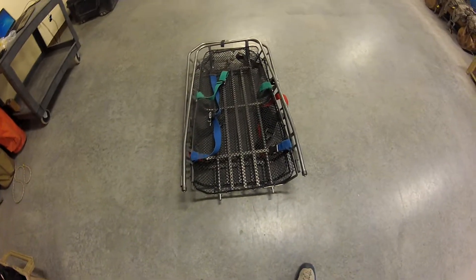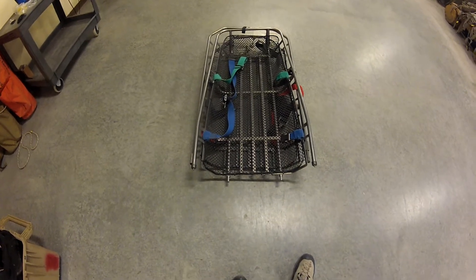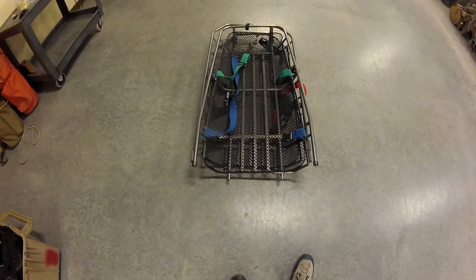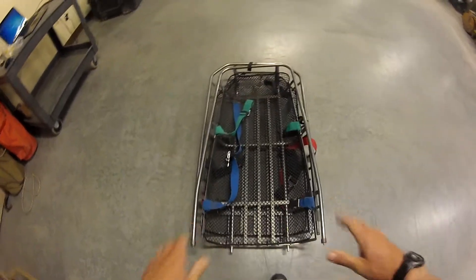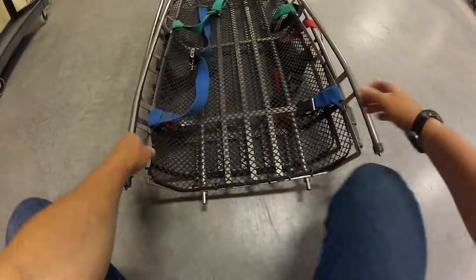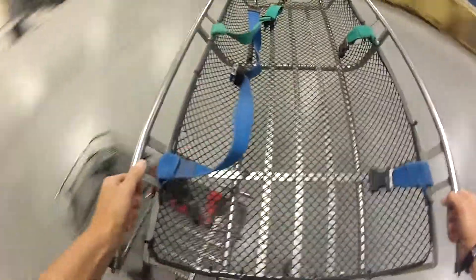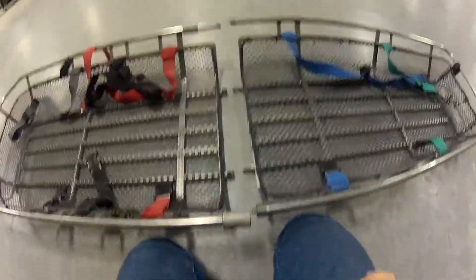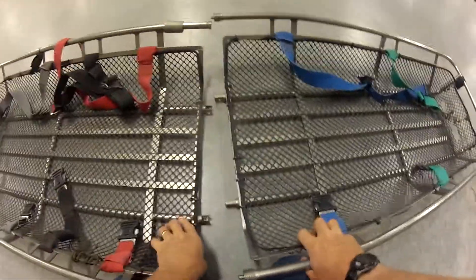This is showing you how to assemble and inspect the titanium Stokes litter. Oftentimes you're going to have it stored like this in two pieces. The first thing you're going to do is take one piece out and turn it around, facing it with the other litter to assemble it.